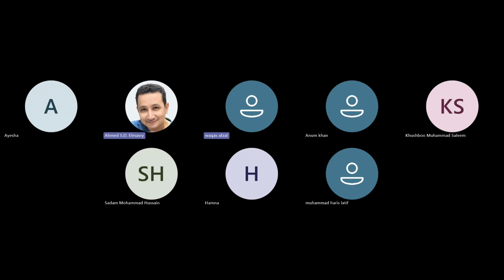So suboptimal augmentation is a thing, but the different thing is that you are doing the balloon inflation in the systole. It's a different story. This is working against the heart, and the other one is suboptimal augmentation. You can adjust the position, so you will get the proper augmentation. But the position problem is not related to the timing.